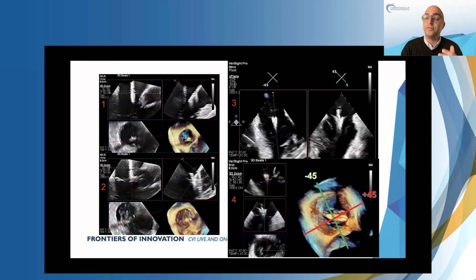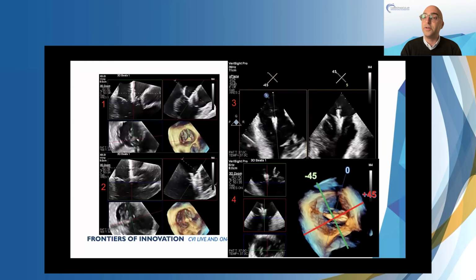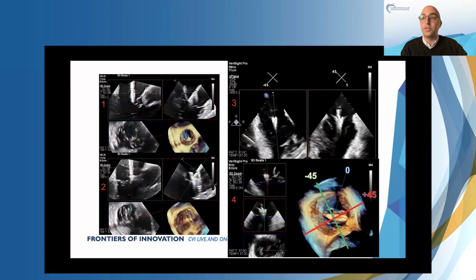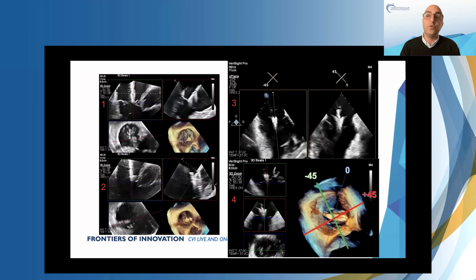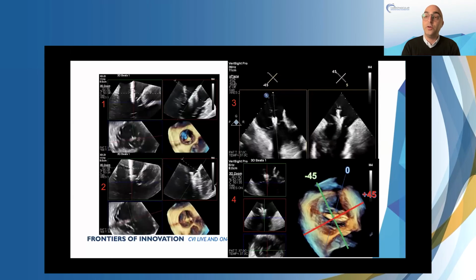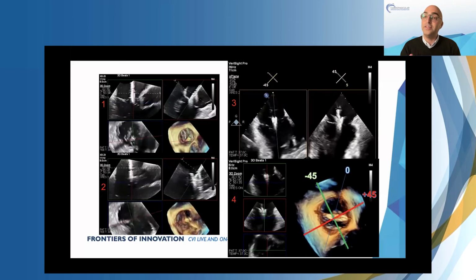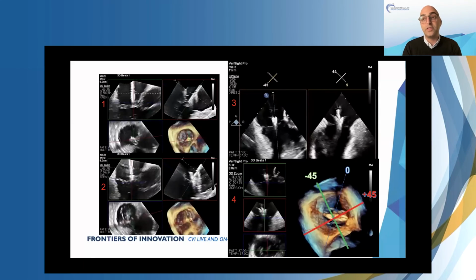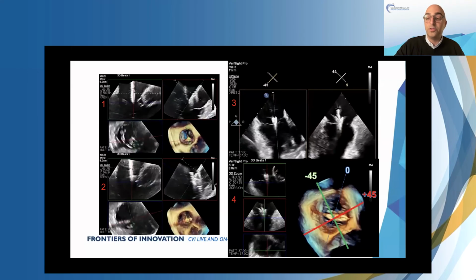But what you do realize is if this represents minus 45 and 45, what you'll also learn is that this is 0 degrees here, which means that your clip is probably not plus 45, probably more like plus 70, and you would probably be parallel to your clip if you get to plus 70, plus 65, maybe even plus 75. So that's a technique that we will often use: we look at the 3D rendering, we look at the lines, and then we can see our clip and we know, hey, this is the angle that's optimal. Hopefully it's in the go zone of 60 or minus 60 or 45, 45. Sometimes it falls outside, but those images are still quite good. And this is a really good example that you can be outside 60 sometimes and the images are very good.